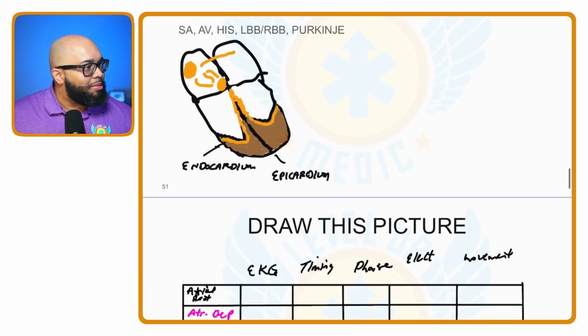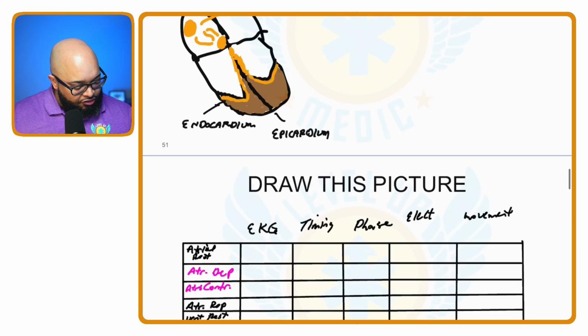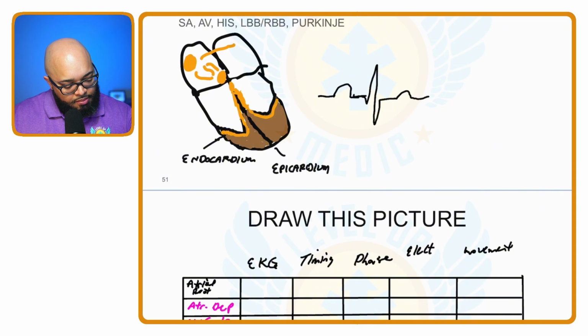Okay, so right before the break, we were talking about this picture, right? And I told you to make sure you know this picture. So the next thing I want to do is tie several things together. Let me just draw out another EKG for you real quick. Okay. So make sure you know how to draw all of this.